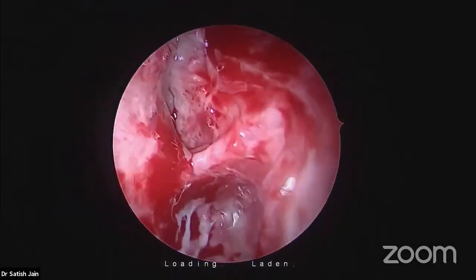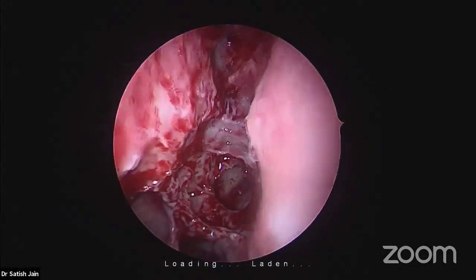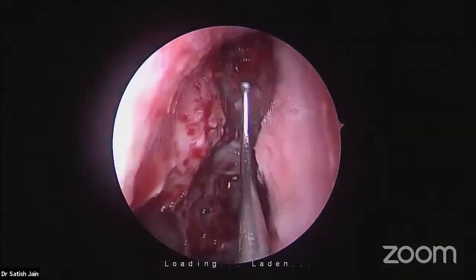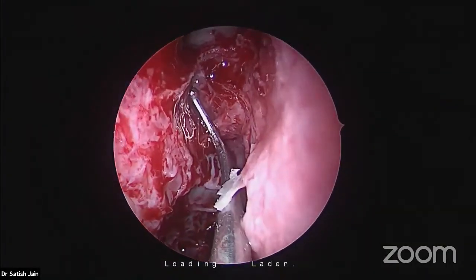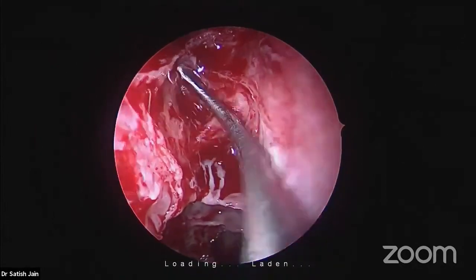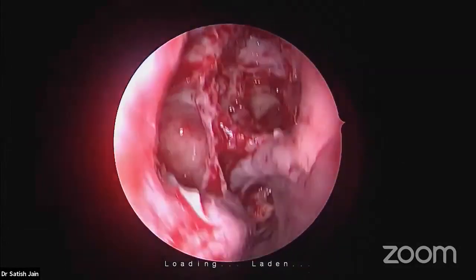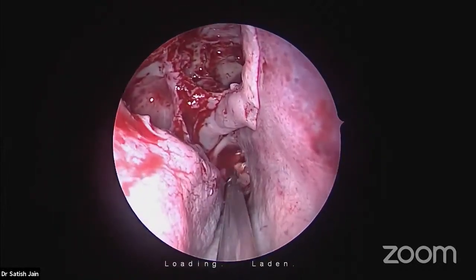Now see this recess. It was shallow on this side, posterior to the frontal sinus, that is supraorbital. On the other side it is more deeper. See this. This is the frontal sinus, and behind this, the recess going up above the orbit. This is very shallow. This is supraorbital. Not very important on this side. So this is about the full house FESS on this side. Any questions?